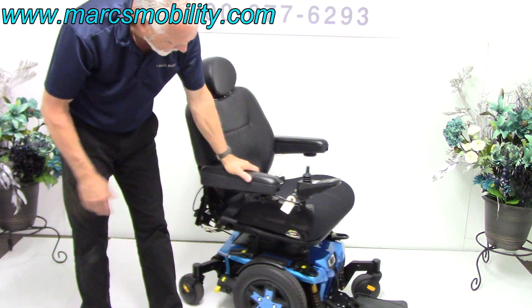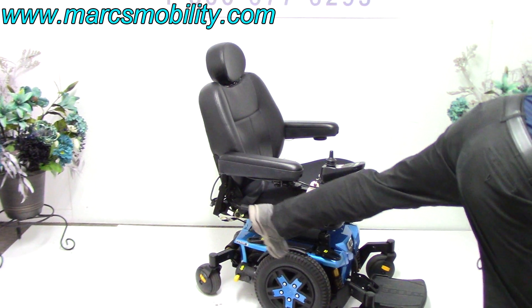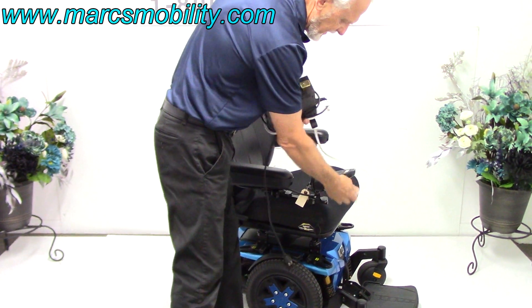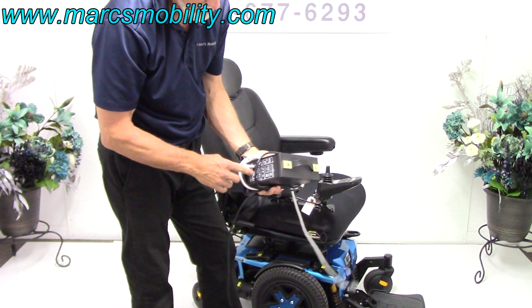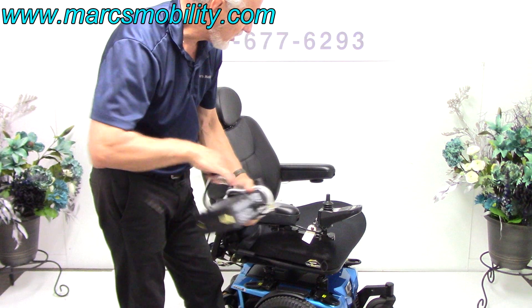This is the Quantum Edge 3. When you charge this chair, like all Quantum chairs, take your Quantum charger and plug it into the bottom of your joystick. When the light goes from orange to green, you're fully charged. The charger will stop charging automatically.